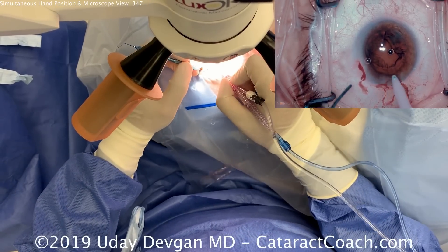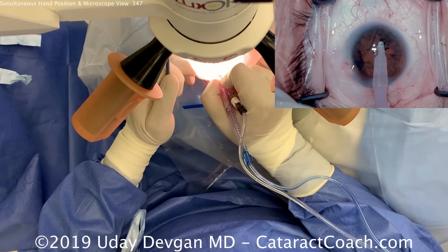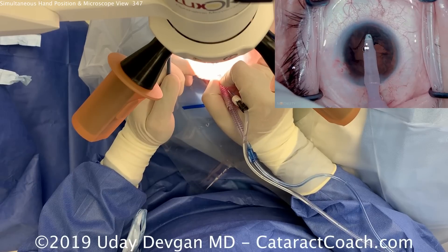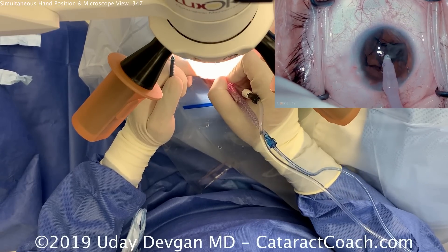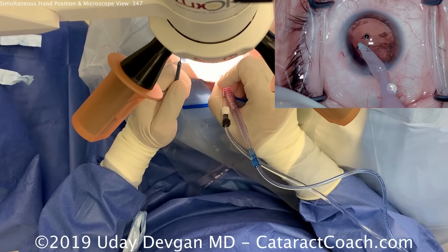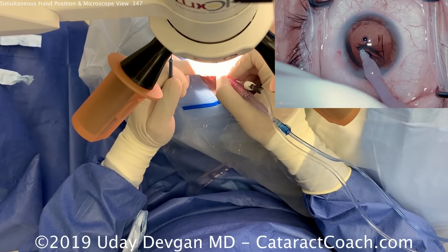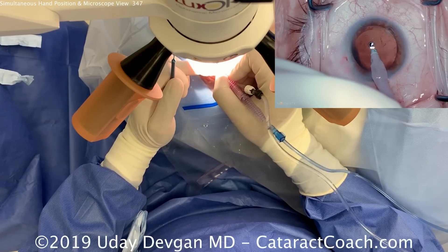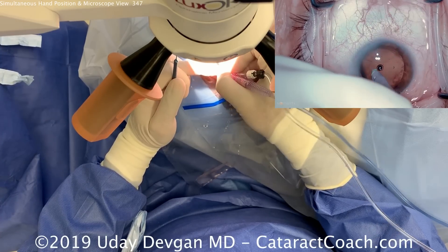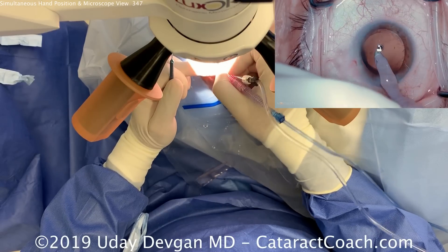Ready for cortex removal. The technician will switch over to the I&A probe. The spatula is now in the left hand — that's the other side of my chopper, I just flipped it over. In case there are any little nuclear chips, we can use that spatula to push them down the aspiration port. Look at how much pivoting there is outside the eye with the right hand — but inside the eye it moves very little. The pivot point is the incision.